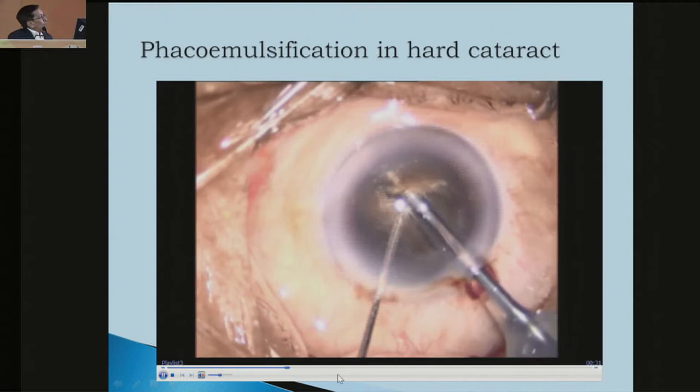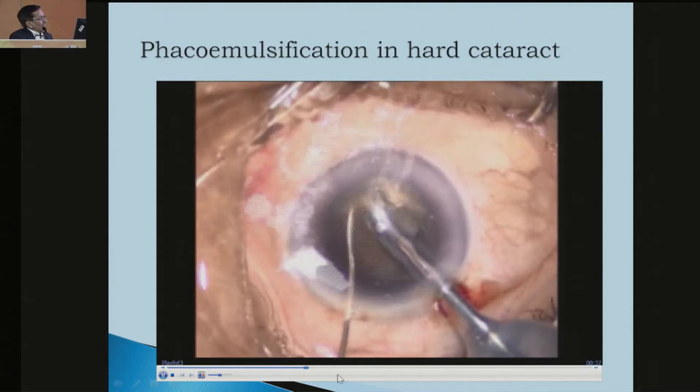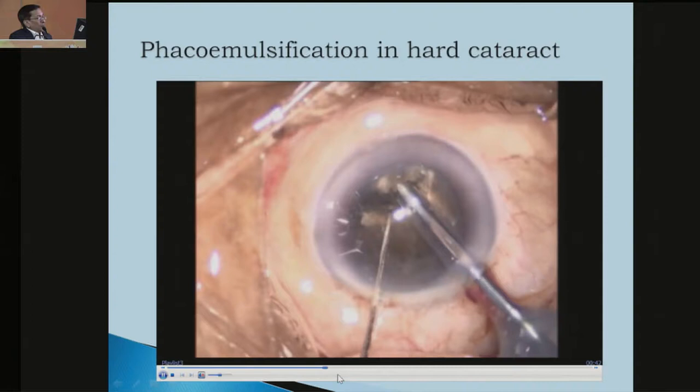Again, give slight phaco energy and with the chopper, crack the section and re-engage. So you can extend this cut up to the central portion of the nucleus.